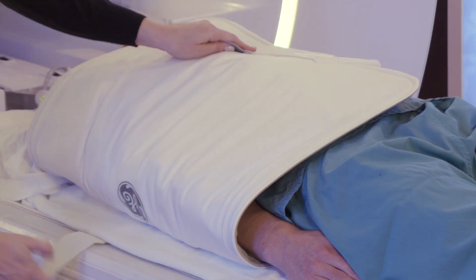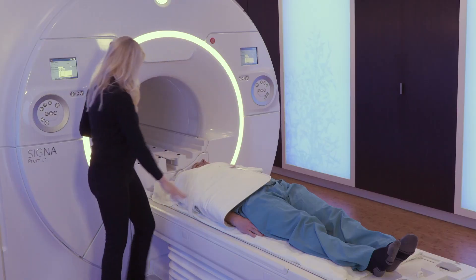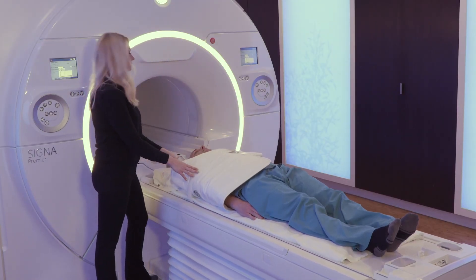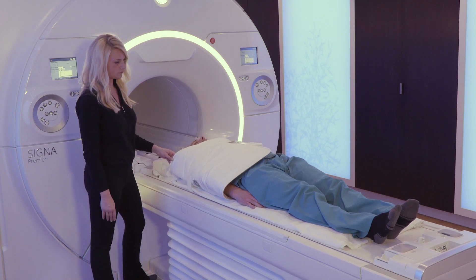Secure the coil with the strap. As with any MRI exam, be sure to use proper padding.